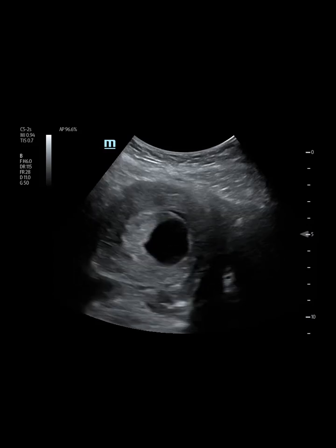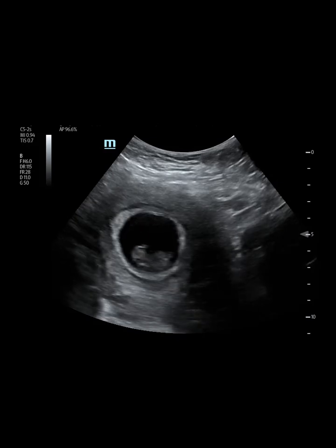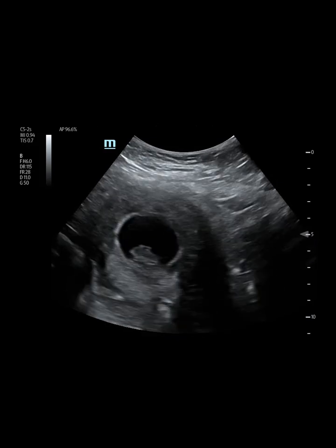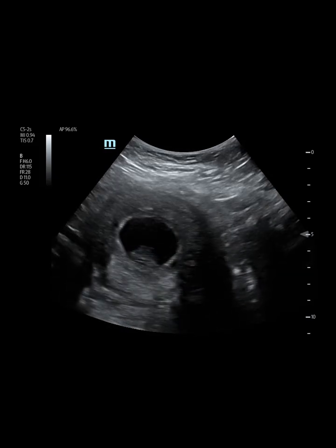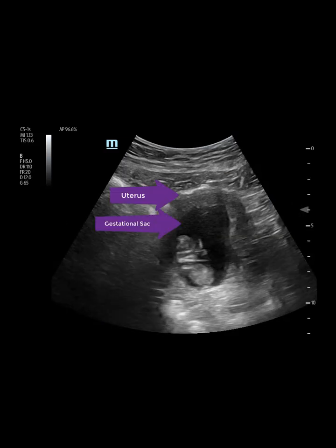We'll choose the curvilinear probe for this scan and choose the OB setting. We'll start by scanning way down low in the pelvis. Generally speaking, it's realistic to start doing these ultrasounds at about 7 weeks gestational age. Before that, it can potentially be challenging to see things properly. In these clips, you'll notice the uterus, the gestational sac, and the fetus.